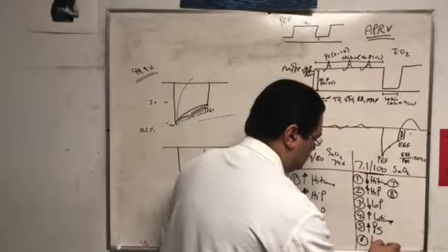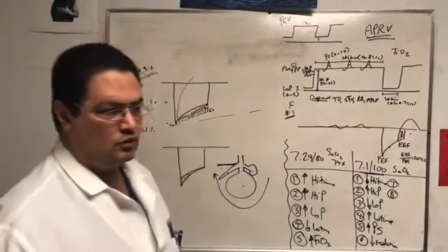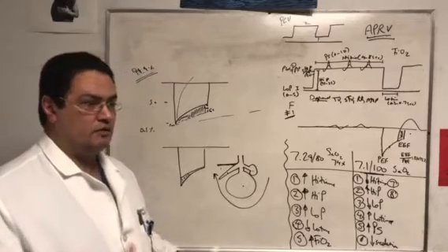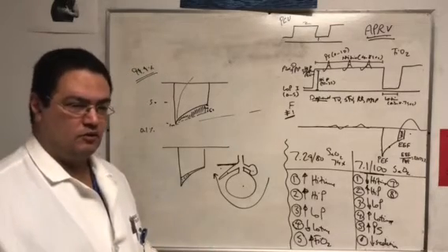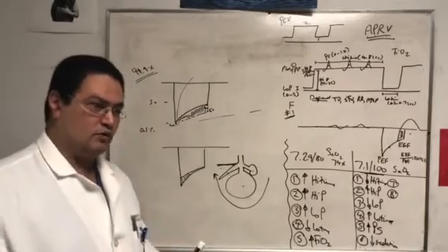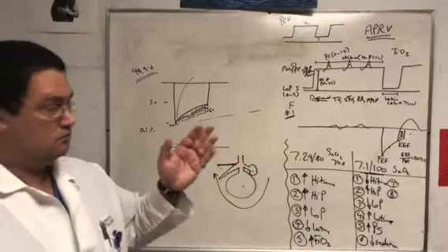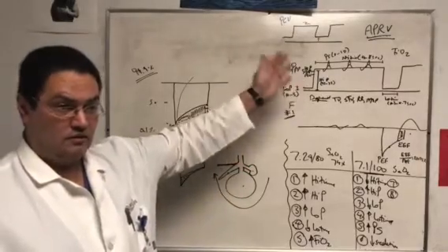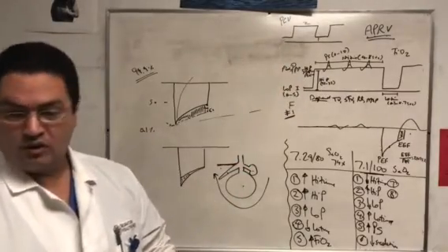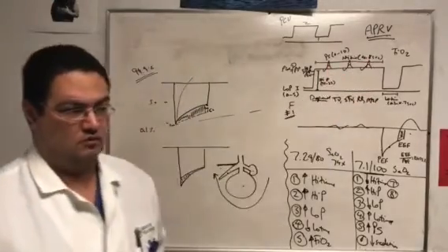Decrease sedation. So what happens in a pressure control or volume control mode when the patient is doing badly? We sedate them more. Doing worse, we paralyze them. We take over, a controlled mode of ventilation. This is the opposite. Another claim to fame of this mode: the worse you get, the more you decrease the sedation, because by decreasing the sedation, there are more of those breaths, and there's more minute ventilation.